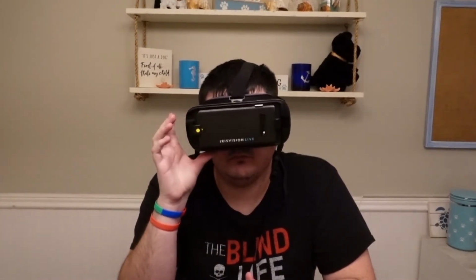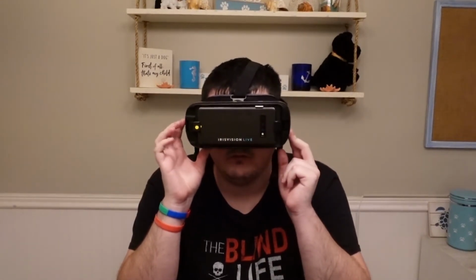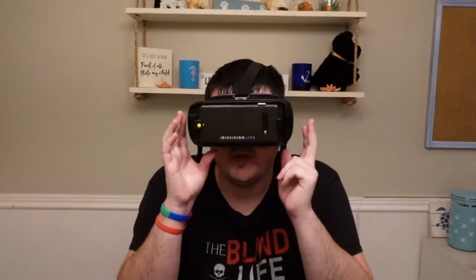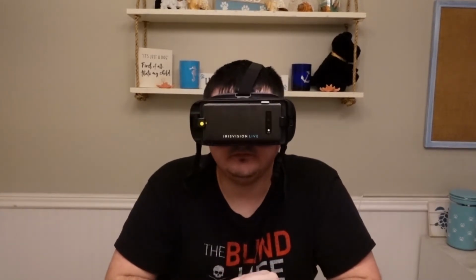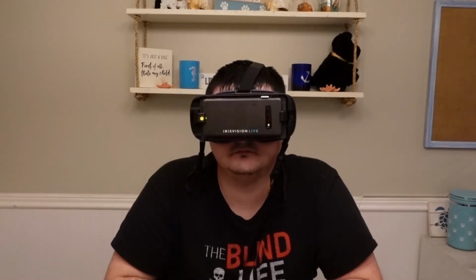Alrighty then. Photo gallery. There are no photos saved in here. But what it would do is, if you had photos saved here, you would be able to view them all in this mode. Photo gallery mode allows you to view snapshots you have saved. The images are stored in the headset and can be exported to your computer.